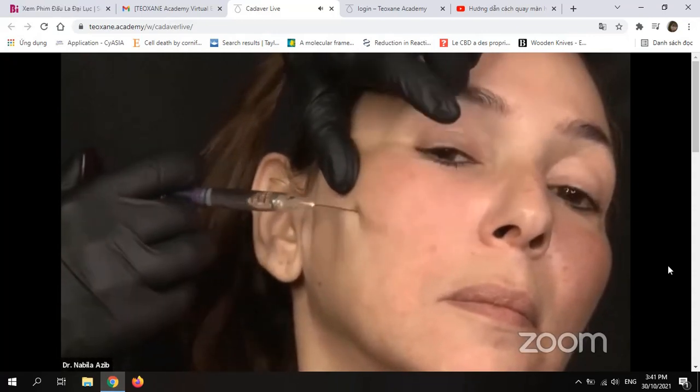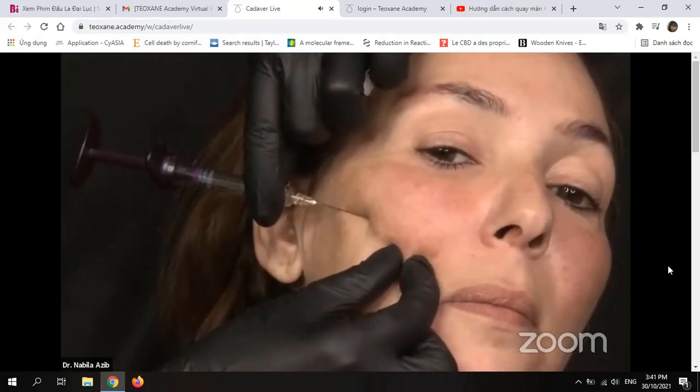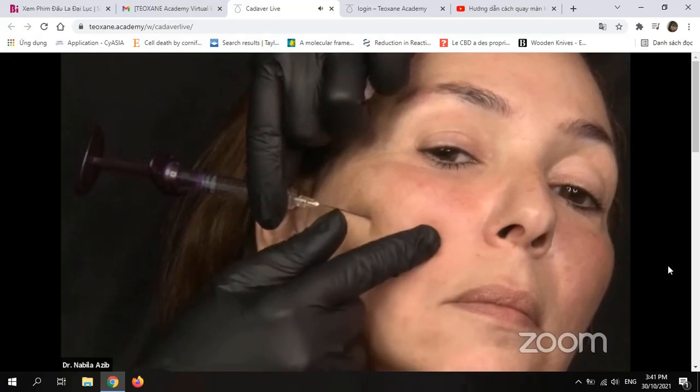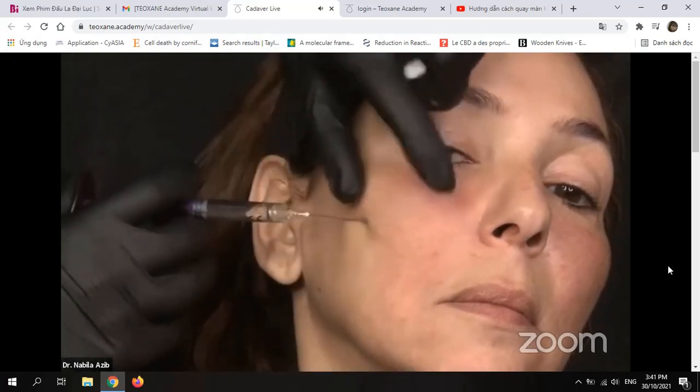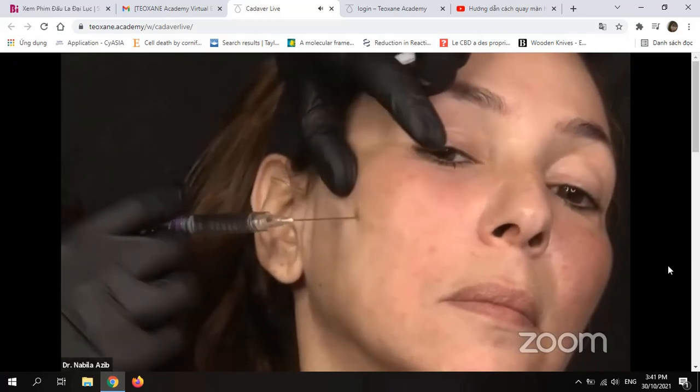So now I stretch the skin, but my limit, remember, is that I'm not injecting on the nasolabial, nasojugal fat compartment here. I don't want to increase the volume already in this fat compartment. So I'm using a fanning technique with the bevel up.